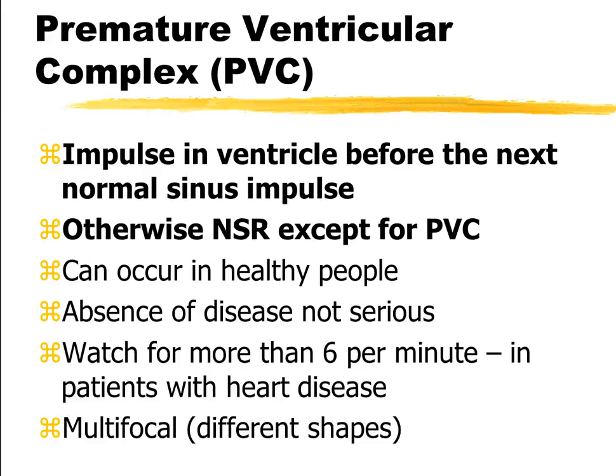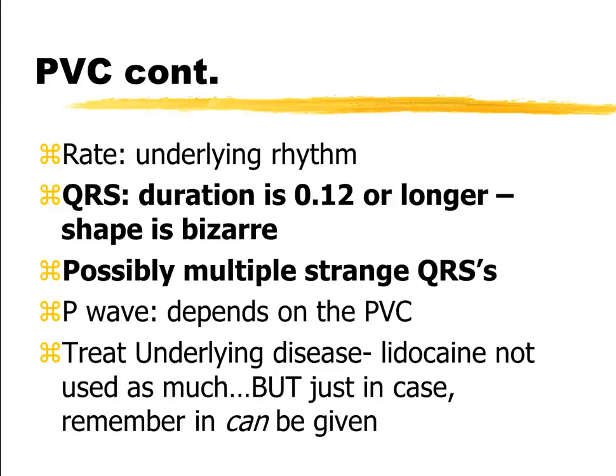Now, if we don't see a lot of them, no big deal. And usually what happens is it's in a similar spot. Like you'll get a part of your ventricle that gets kind of excitable and says, hey, I want to be the new pacemaker of the heart, and he just sends off an impulse. And it's not in the proper conduction system, so what ends up happening, you have this funky looking beat. I'll show you what it looks like on a pattern here in a minute.